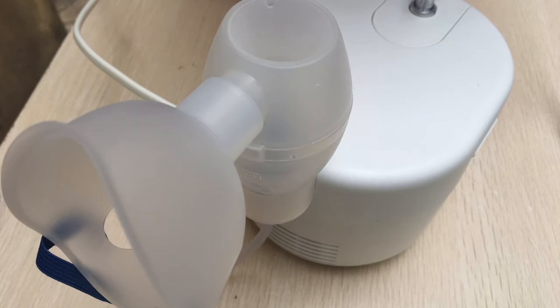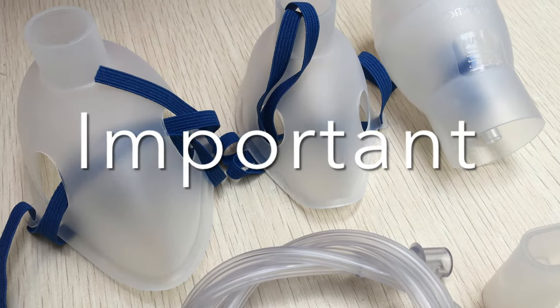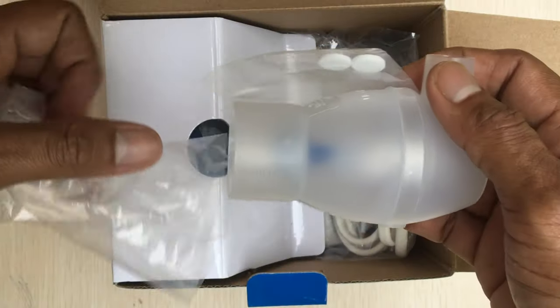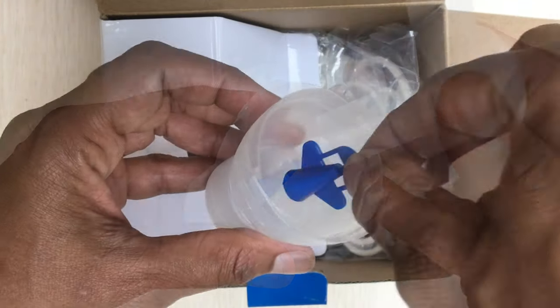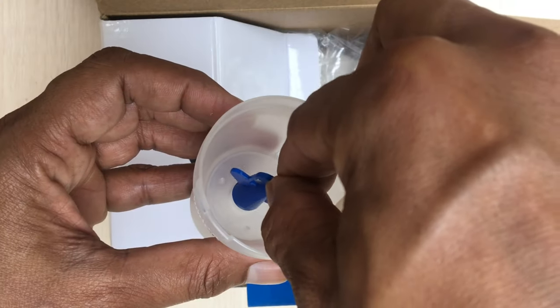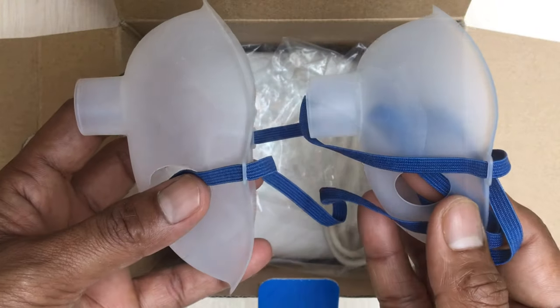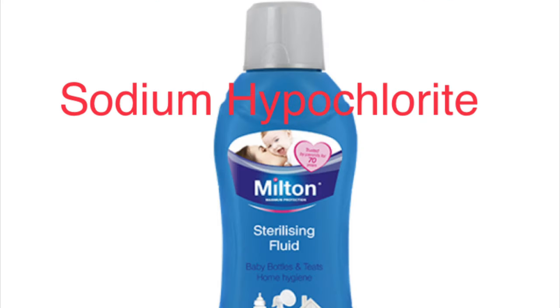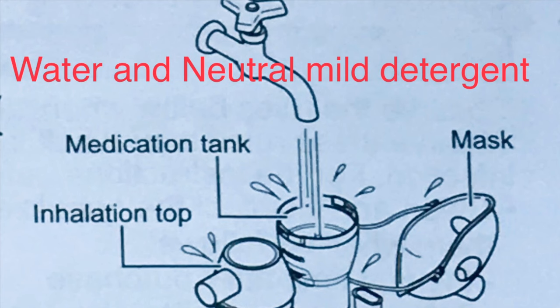Friends, let's see how to use the Omron nebulizer kit. First, the important thing to check is that the kit is clean and dry. The parts like the inhalation top, vaporizer head, medication tank, mouthpiece, and the mask can be cleaned using commercially available disinfectant or simply using warm water and neutral mild detergent.